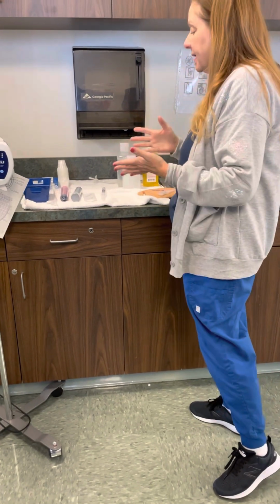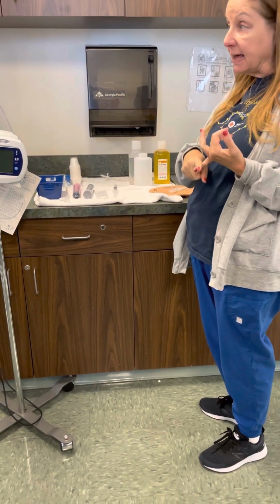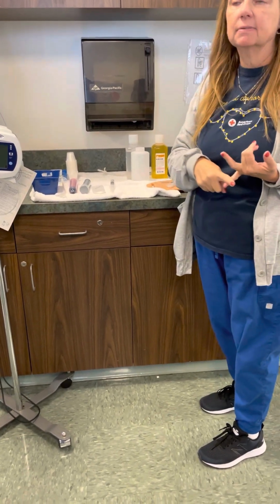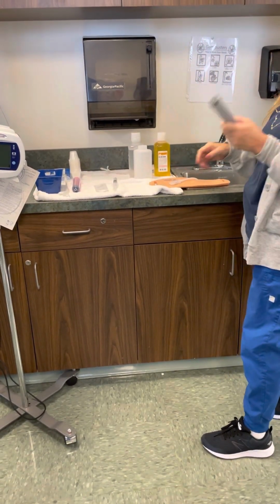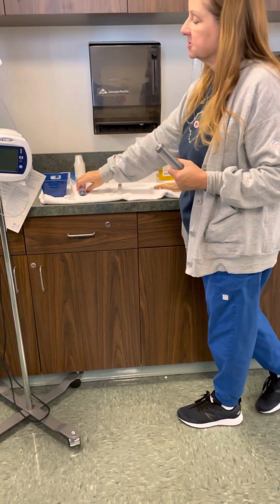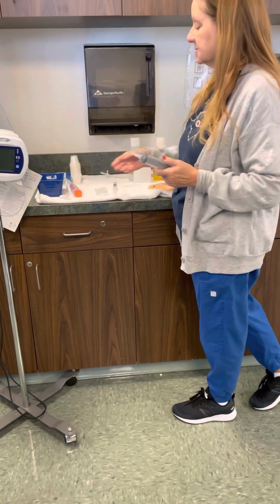And so I'm going back to the patient's room now, and I'm going to go ahead and check for placement. After name and date of birth, I'm going to check for placement, and then I'm going to give the medications. All right? So the first thing I'm going to do is take my syringe. I have to make sure I have the right kind of syringe. Usually, some tubes have a special syringe that comes with them, like this tube right here does.